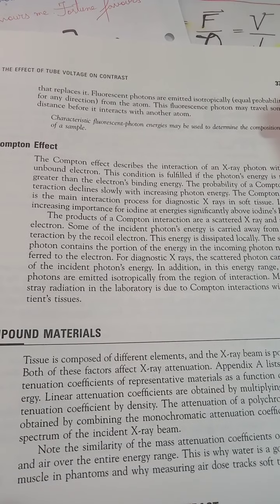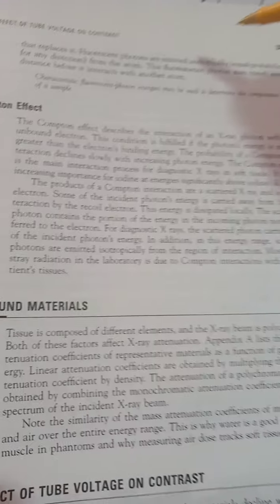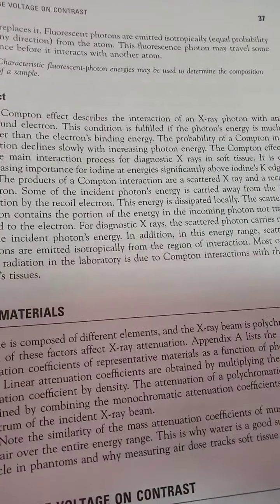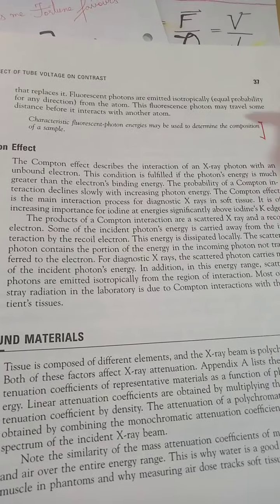The fluorescent photons may travel some distance before they interact with another atom. So the level of interaction is very high. They're quite active in their interaction, and characteristic fluorescent photon energies may be used to determine the composition of a sample, so they're quite diagnostic as well. More uses than the ejected electron.